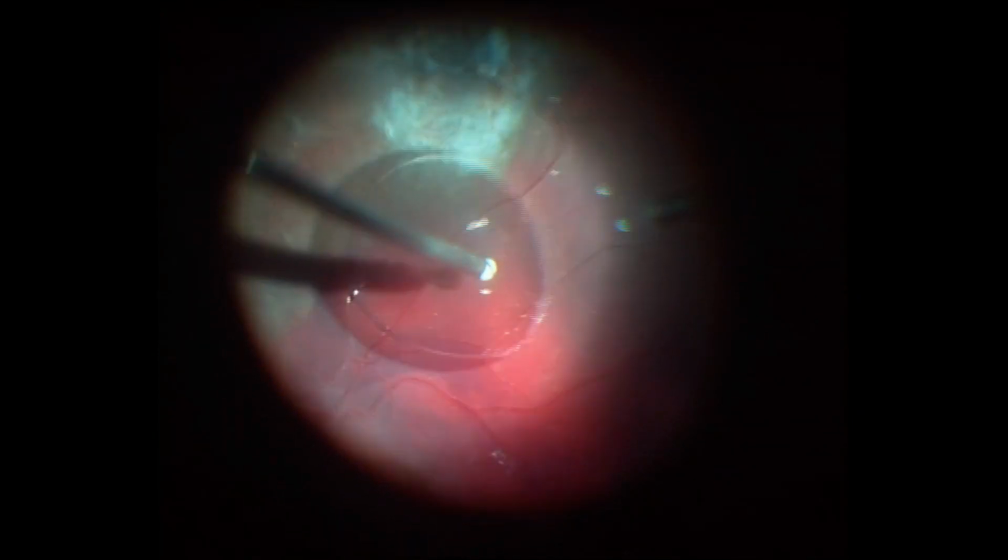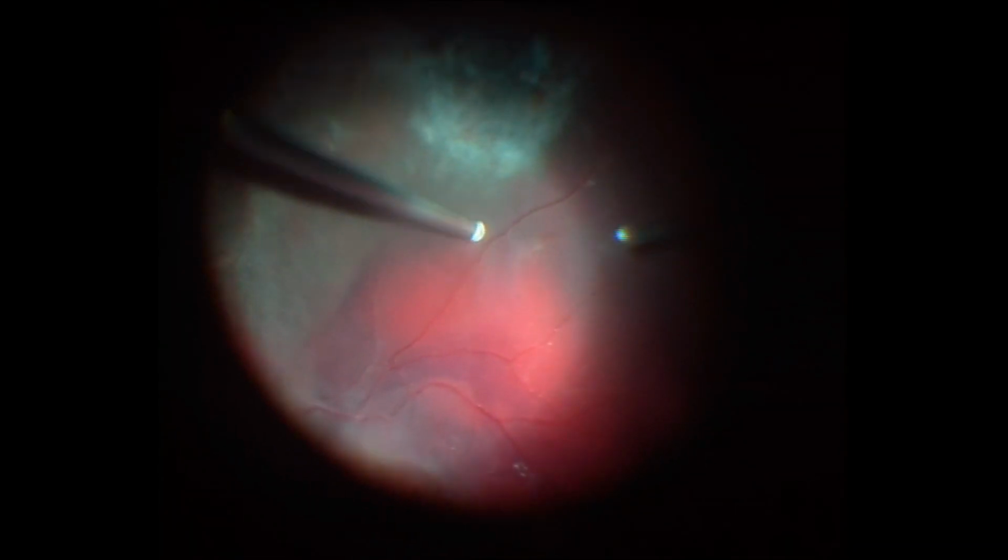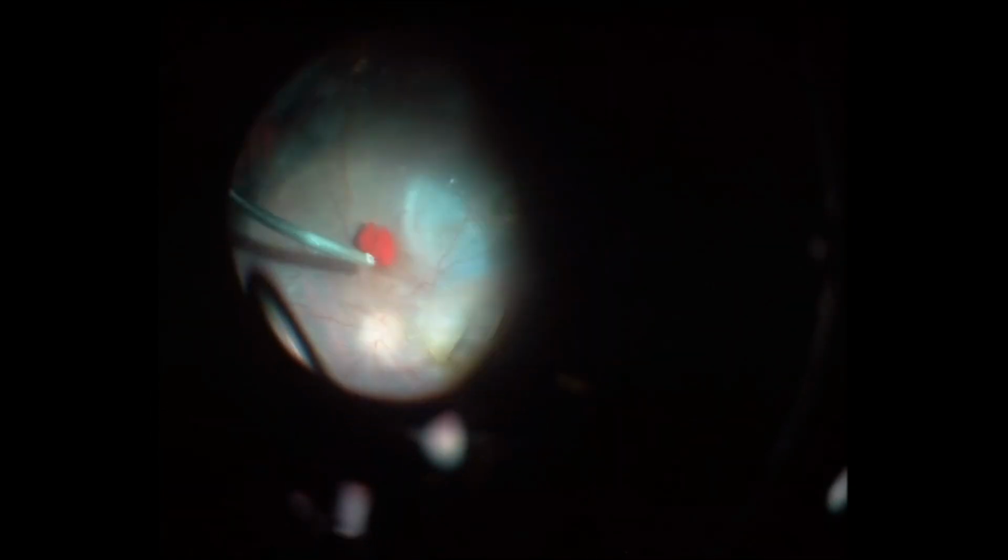Later, the PFCL was removed, an inferior retinotomy was made, and the clotted blood was successfully removed using the vacuum of the cutter. The blood was gently sucked out from underneath the retina, preventing the enlargement of the retinotomy site. Once the blood was successfully removed, further surgery was completed in an uneventful manner.